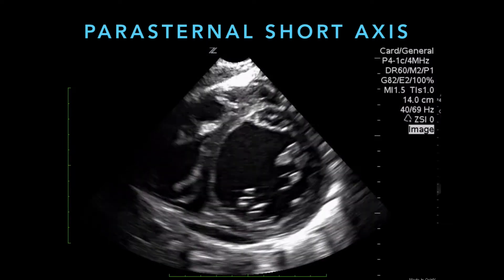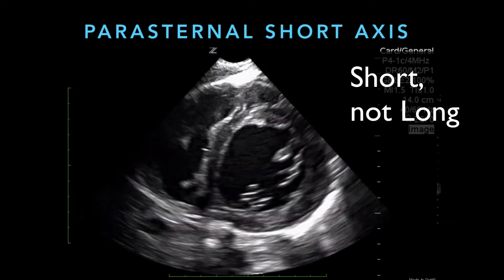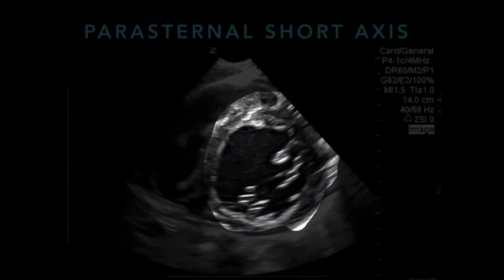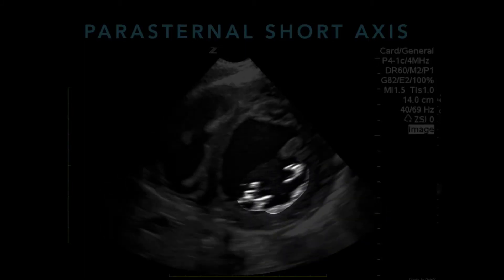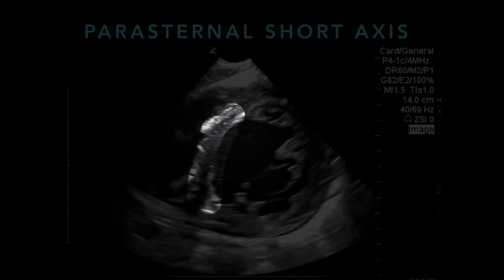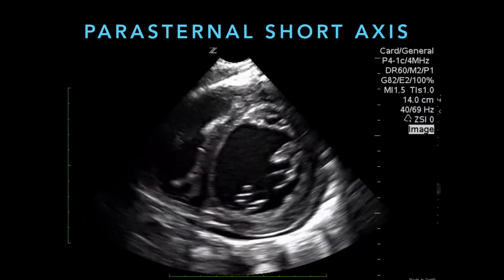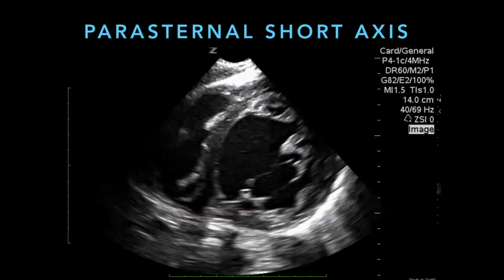Here's an example of a parasternal short axis, and this is a patient that has heart failure. You can see the left ventricle like a circle, like a donut, and the mitral valve is here in the middle. You can tell the mitral valve is not opening well, and you can see that the muscle is not squeezing very well either. On the top left of the left ventricle is the interventricular septum, and the right ventricle is past that. There is a tiny pericardial effusion on this patient as well, visible mostly on the bottom part of the image.